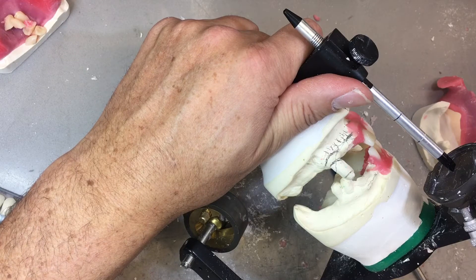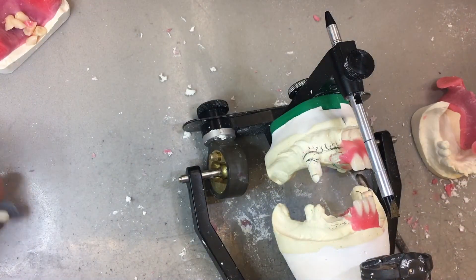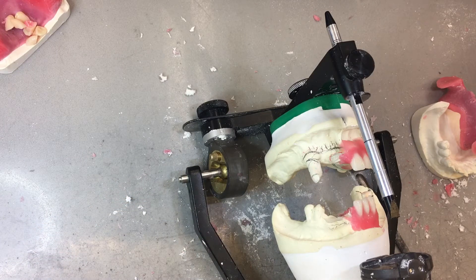Then after surgery, this is going to go straight in. We can't run the risk that the patient is anesthetized and there's no way the oral surgeon is going to take out a denture burr and start trimming your denture. It's gotten to the point now in practice that many surgeons will send the patient back to the dental office or the denturist office and say, you insert the denture. The downside to that is while the patient's driving over, they're swelling up. The denture might not fit anyways.